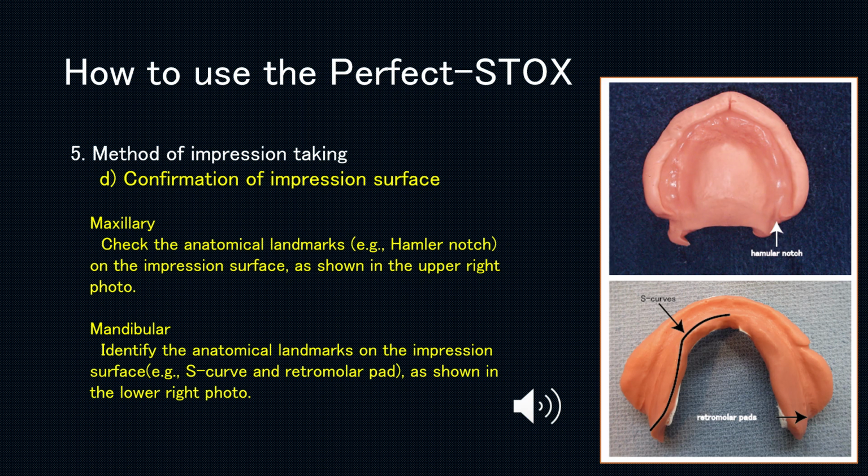Mandibular. Identify the anatomical landmarks on the impression surface. Example, S-curve and retromolar pad, as shown in the lower right photo.